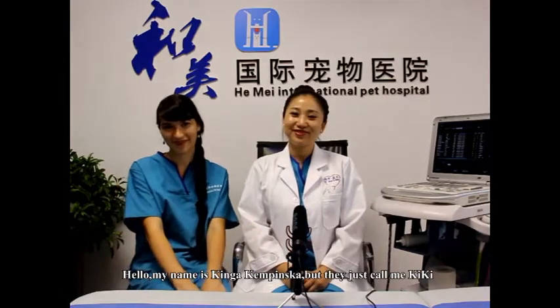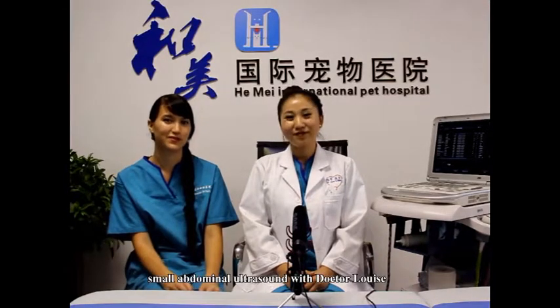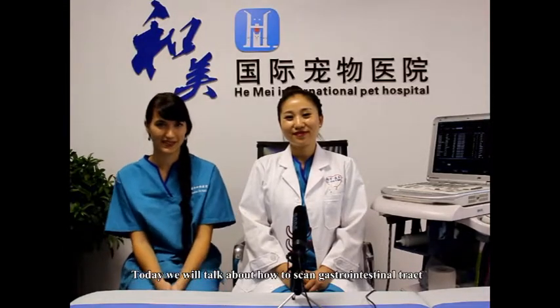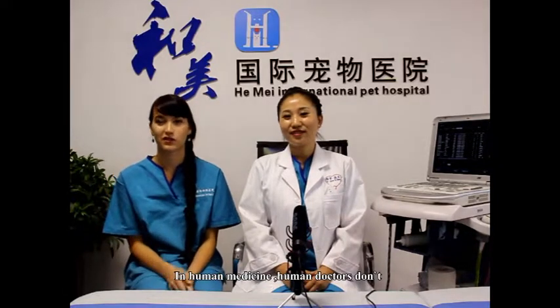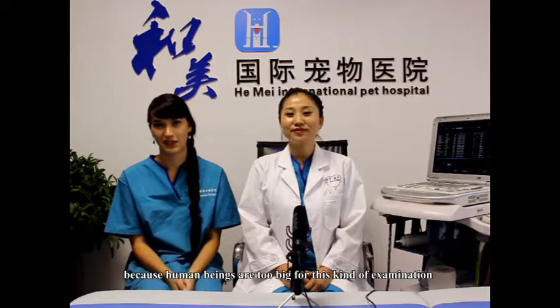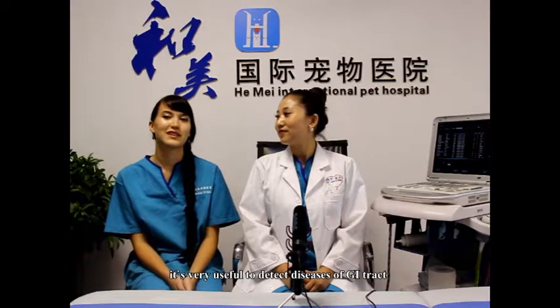Hello, my name is Kinga Kempinska, but they just call me Kiki. I came from Poland to learn small animal abdominal ultrasound with Dr. Louise. Today we will talk about how to scan the gastrointestinal tract. In human medicine, human doctors don't use ultrasound examination for evaluating the GI tract because human beings are too big for this kind of examination. But in small animal practice, it's a very useful tool to detect diseases of the GI tract.